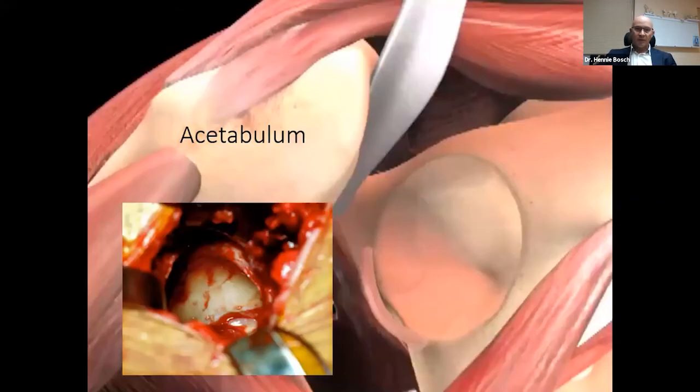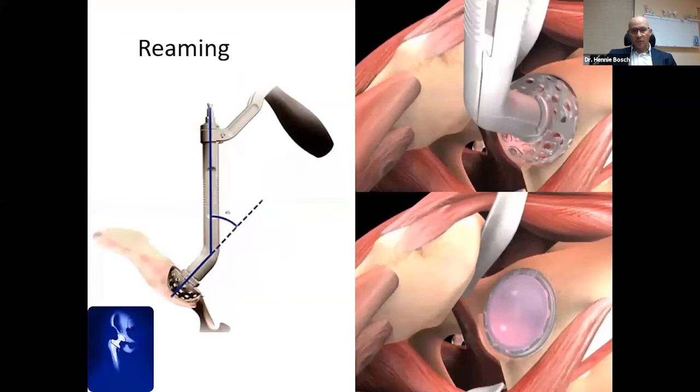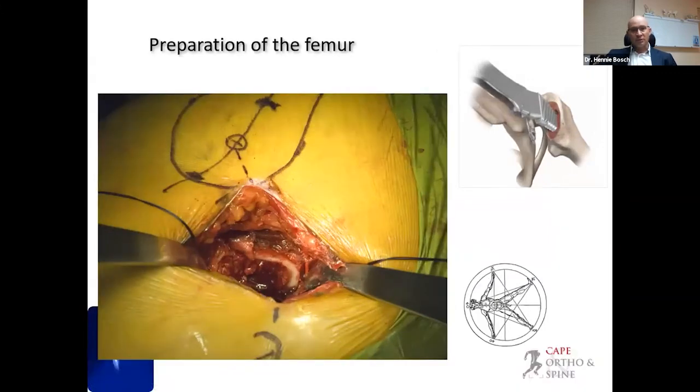The acetabulum I can nicely visualize with this lateral position, or patient on the side, like my posterior approach. I can see my labrum, I can see my transverse ligament, and orientate the cup accordingly. We all use special instruments which are offset so that we can do this surgery. I think that's all the same in all these surgeries. On the side, I will use a pocket, and when I started off, I used 2 assistants, and that was a problem later. And I'll explain that to you shortly.